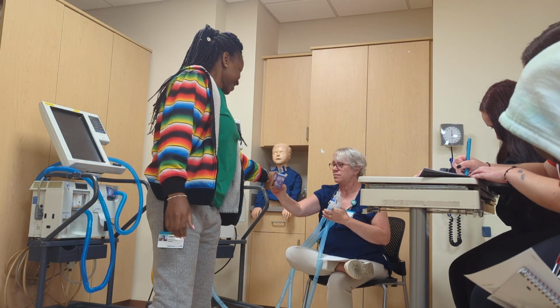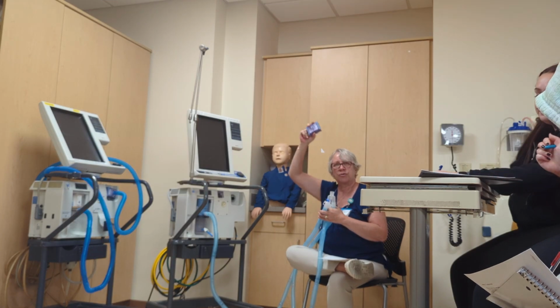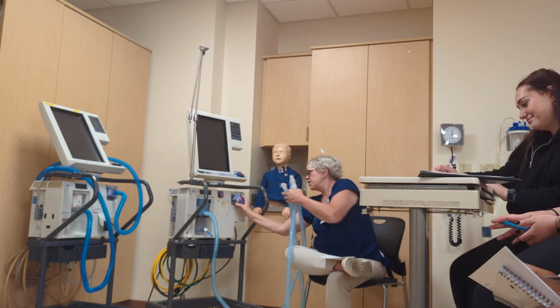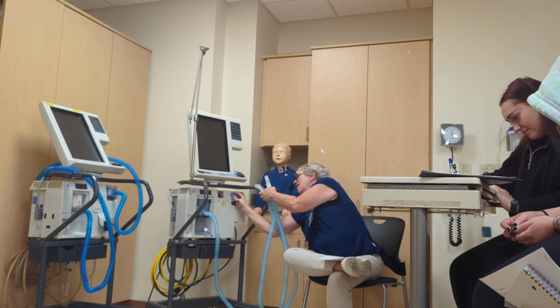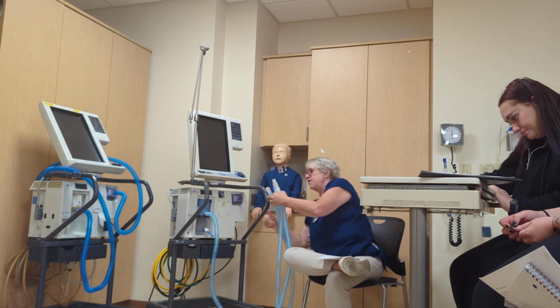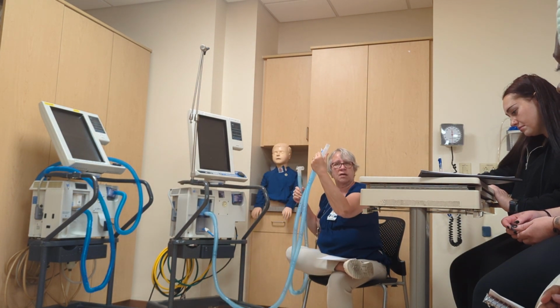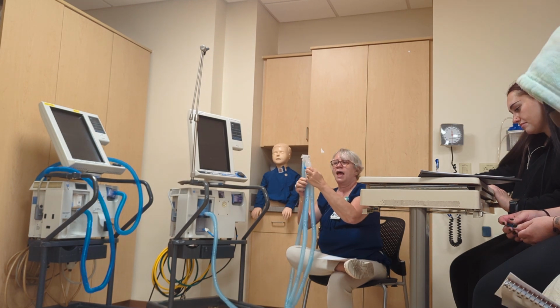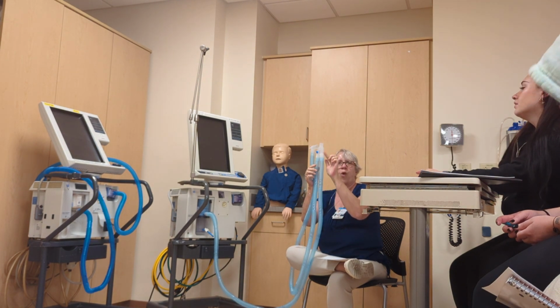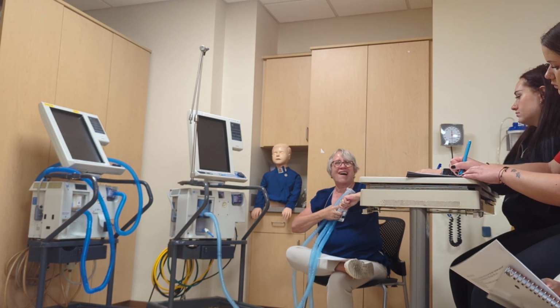All right. So your gas flows from the ventilator through the inspiratory filter. It goes through the inspiratory limb, the corrugated tubing, and then it comes up to this Y. Okay? This is your Y connector.